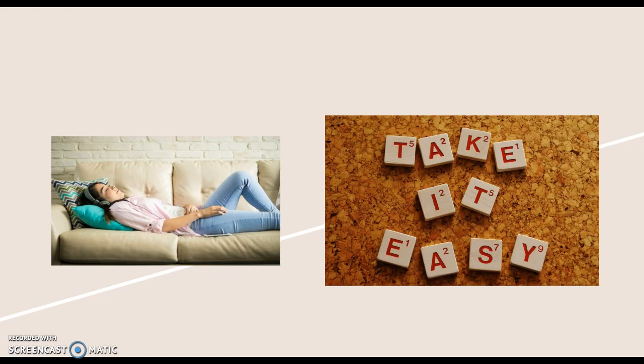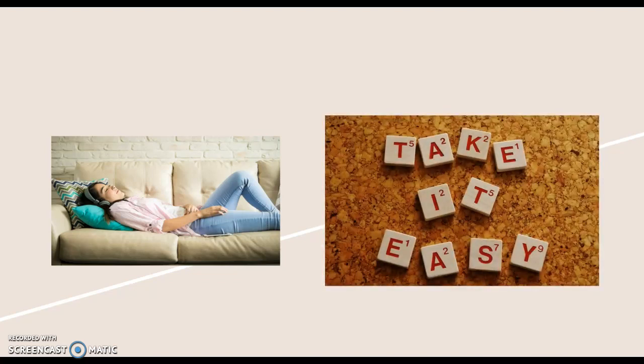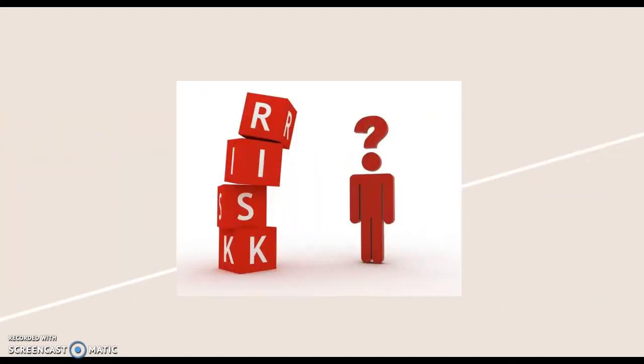Also, to prepare for the exam day, patients should plan to take it easy and avoid being overly active. Vigorous activity is to be avoided during the study, such as jumping or running, but individuals should be able to go about their day somewhat normal after the pill is swallowed. It is a semi-comfortable procedure compared to many, as patients are able to drive and go to work, depending on the job, after the pill is consumed. It is a generally safe procedure with little chance of complications.